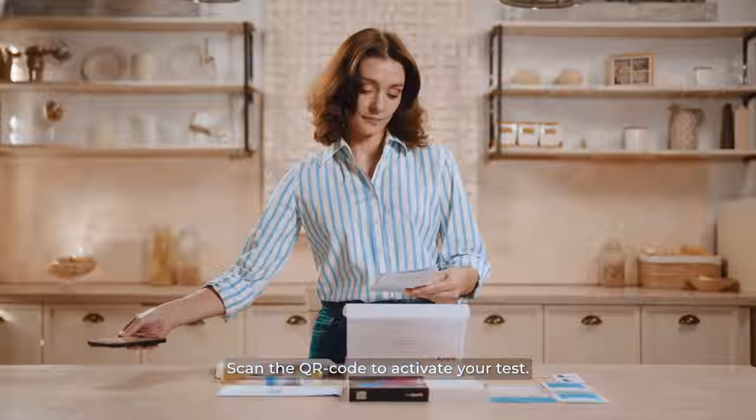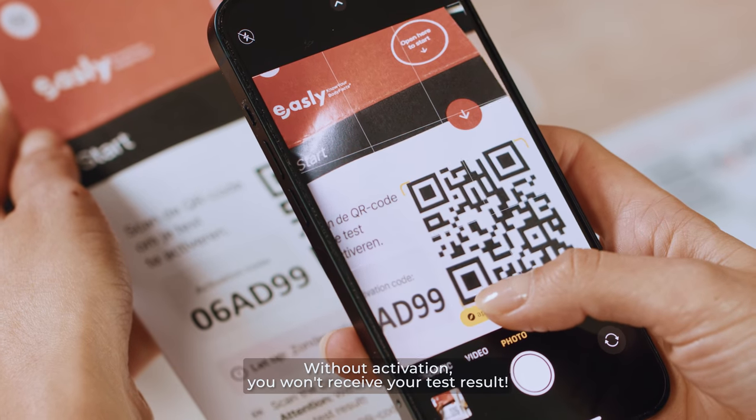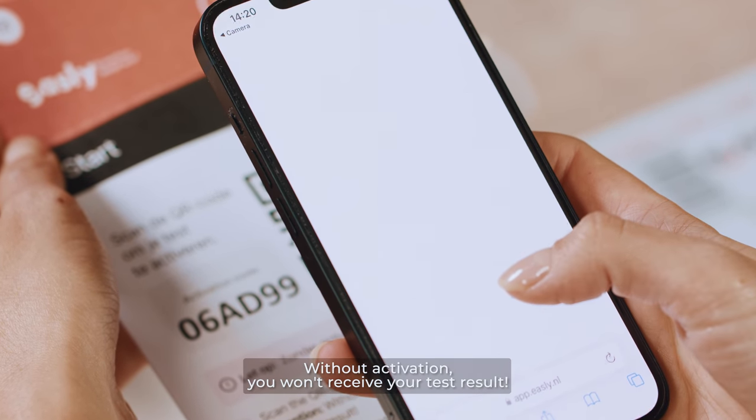Scan the QR code to activate your test. Without activation, you won't receive your test result.